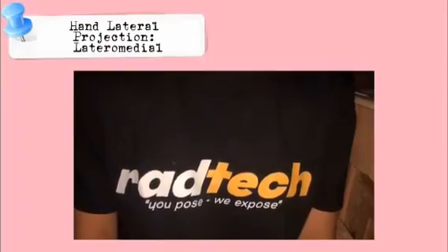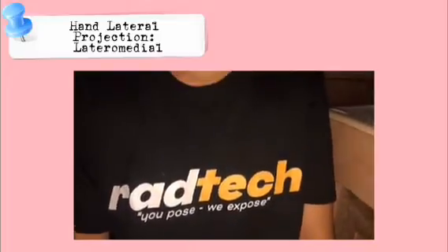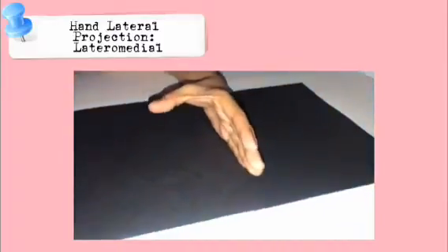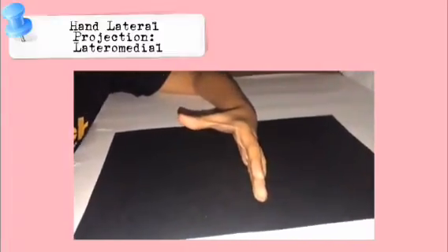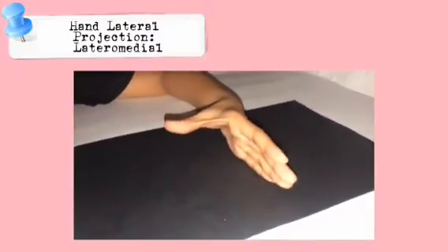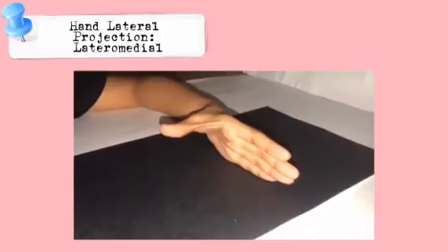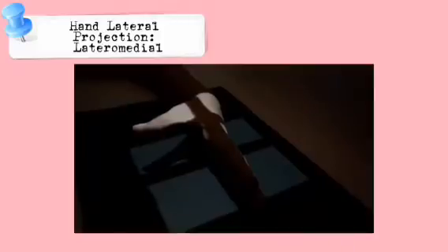The position of patient in hand lateral projection, mediolateral or lateromedial, extension and fan lateral are the following. Seat the patient at the end of the radiographic table with the forearm in contact with the table and the hand in the lateral position with the ulnar aspect down. Alternatively, place the radial side of the wrist against the IR. However, this position is more difficult for the patient to assume.